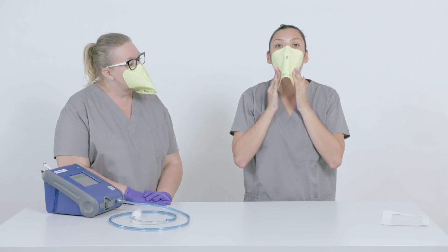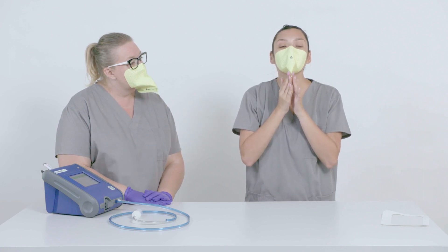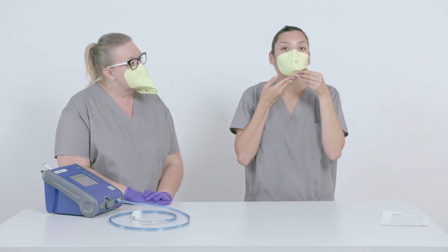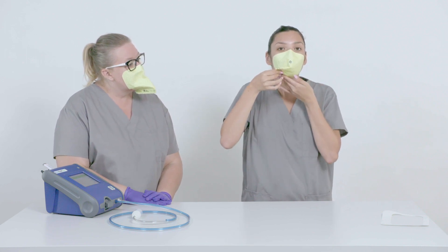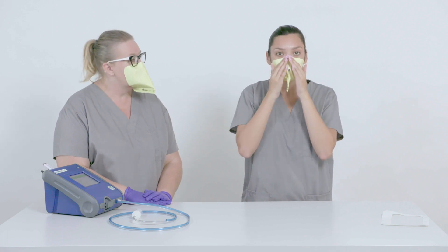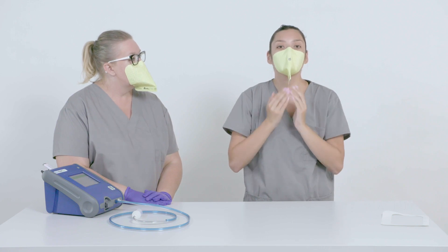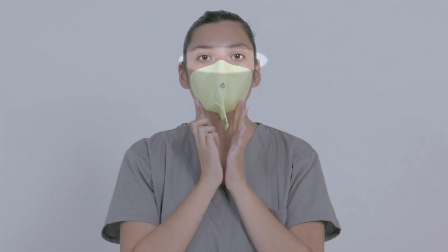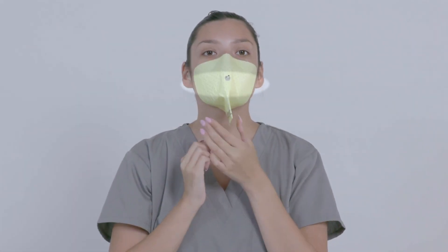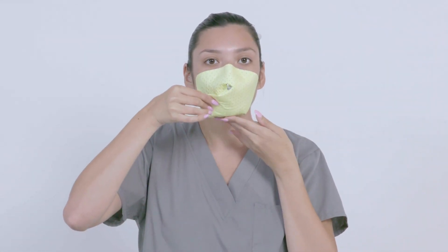Step four: apply the mask to the face according to the instructions for use. As an additional check, have the test subject press around the entire seal again, paying special attention to the nose and cheekbones as well as the area under the chin, as these are the most common sources of leaks. Have the subject wear the mask for five minutes before beginning the test.